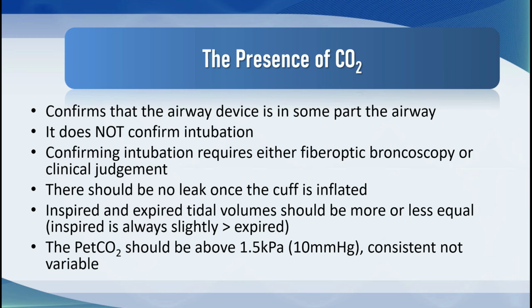In my view, the only way to truly confirm intubation is to put a fiber optic scope down through the tube and see the carina. For most of us, most of the time, there is a degree of clinical judgment. There should be no leak once the cuff is inflated. Inspired and expired tidal volumes should be more or less equal.